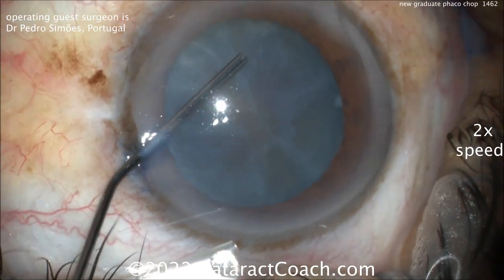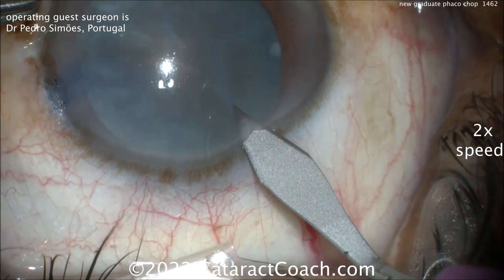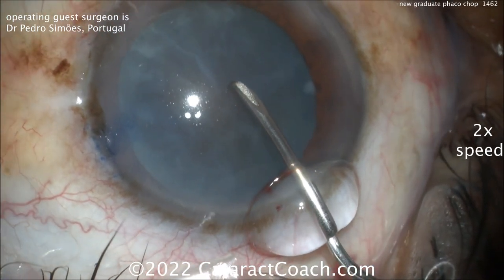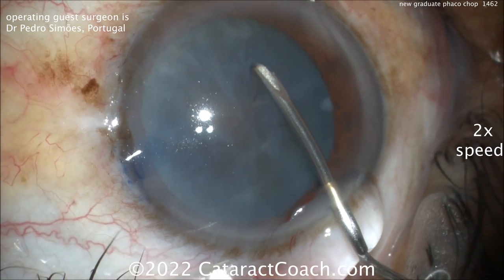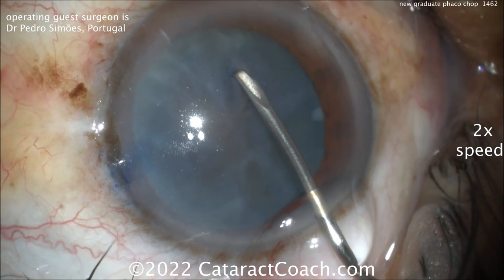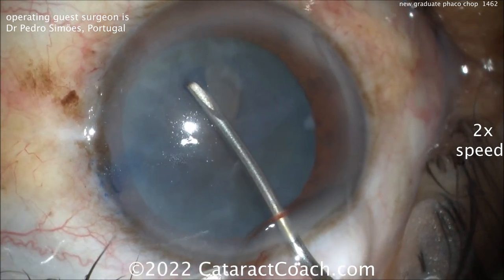He's a new graduate, and a few eyelashes in the way — but you know what, that happens to the best of us, me included. So there's the incision, a little short from my preference, but it looks like a good incision. Let's see the rhexis. Trypan Blue Dye was obviously used to stain the capsule, and we'll get this rhexis done.